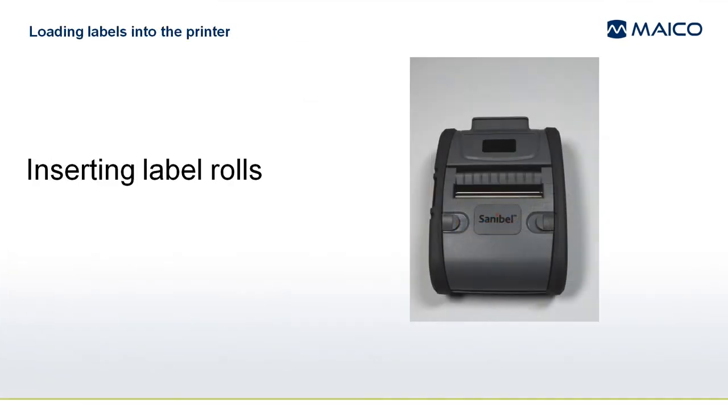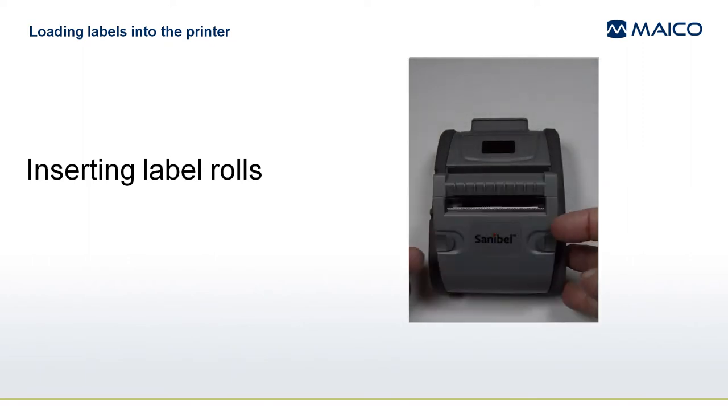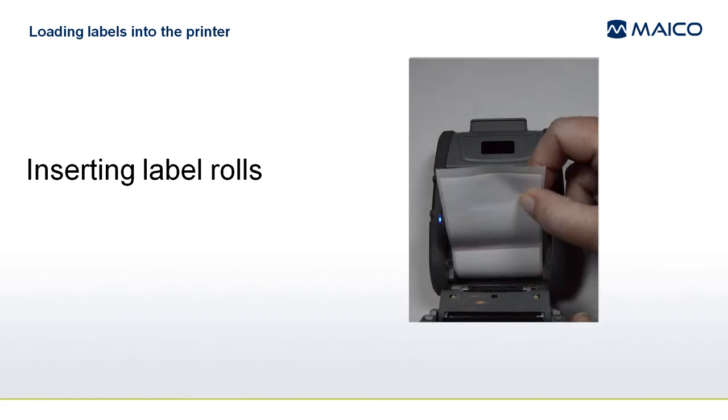To load the label roll into the printer, open the cover by squeezing the two latches together and allowing the cover to spring up. Turn the printer on by pressing the power button. Free the end of the label roll by removing the sticker. Insert the roll with the labels facing the cover.